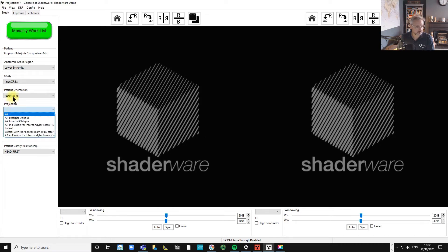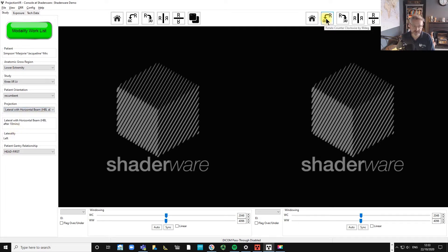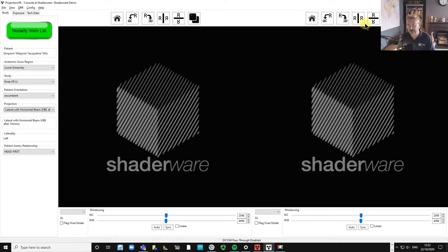So what we're going to do is, as she's recumbent, we're going to be doing a lateral with horizontal beam. Do the AP projection first and then set up for the horizontal beam lateral, not the other way around.